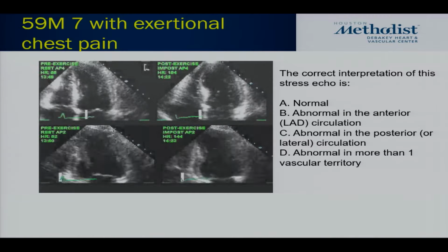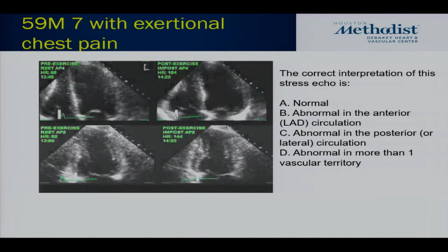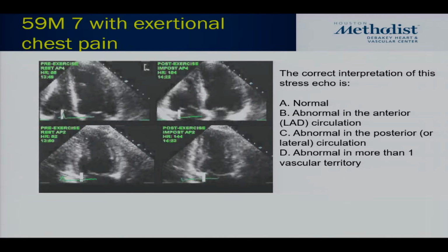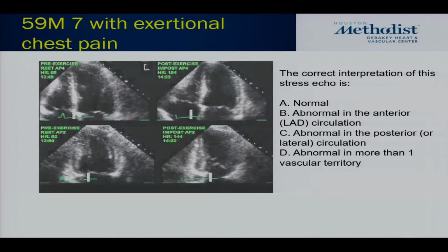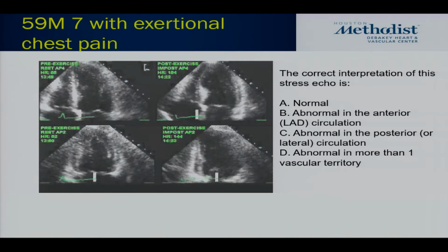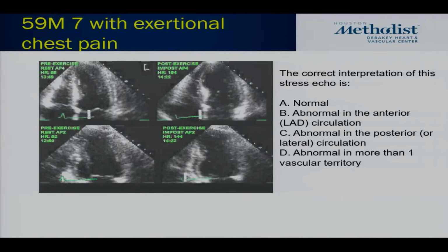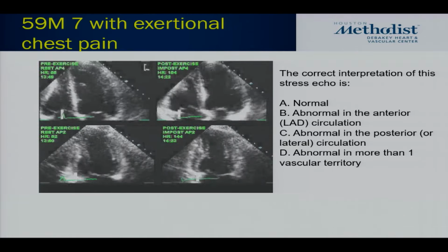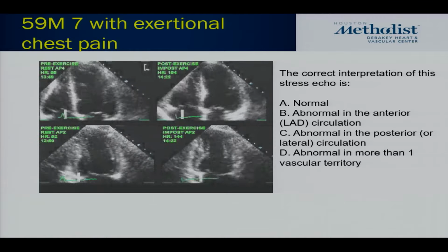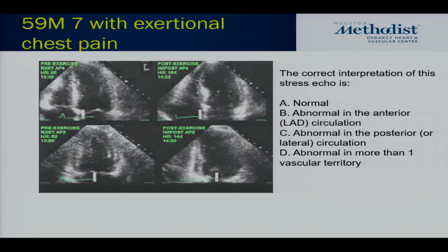And what is that phenomenon called? Anyone? Post-systolic thickening, right. And it is pathognomonic of ischemia. That's exactly what you see in the cath lab when you clip a vessel. The very first thing you see is akinesis, no thickening in systole, early diastole, boom, it thickens. Eventually, it may not thicken at all. But in early ischemia, you see this in diastole.